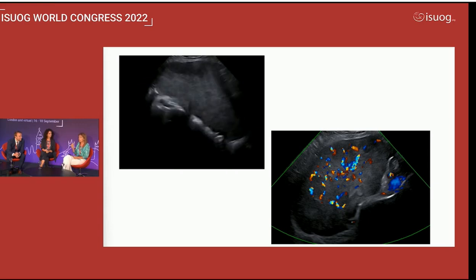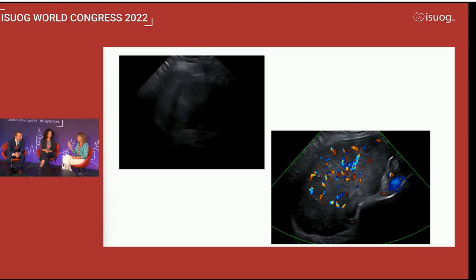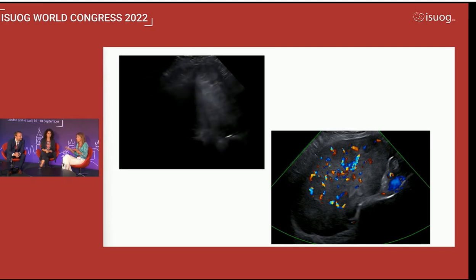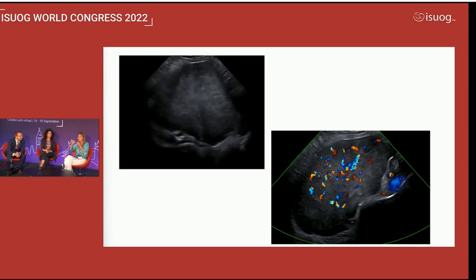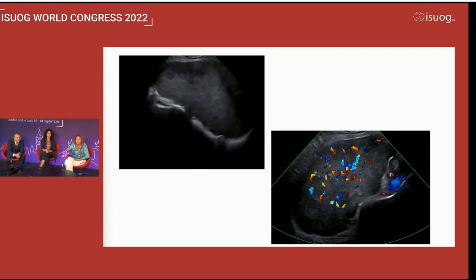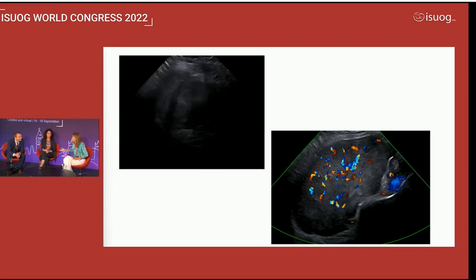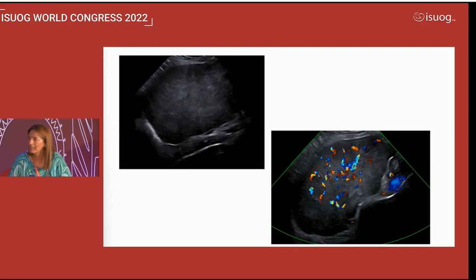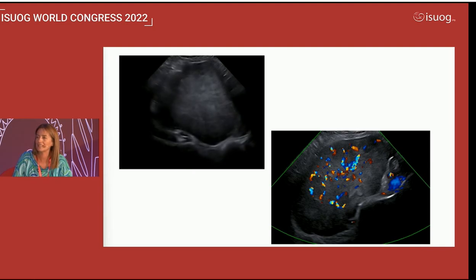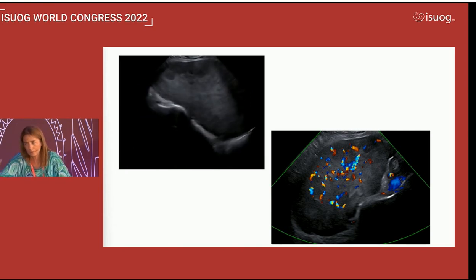And if I consider what we learned of these germinomas, you remember we discovered that anatomically the pathological textbooks taught us that they are characterized by septa within a solid lesion. If we look at that, do you recognize the septa? You do. And to me, I would make a suspicion of this germinoma. So not granulosa, for instance, because usually you find some cystic areas. So here, I would exclude ovarian fibroma, but I don't know, it could be.